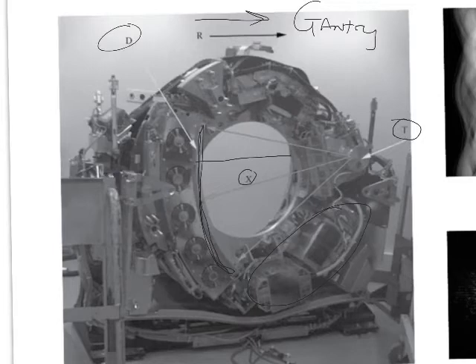So along this imaginary point that's the isocenter, if I were to stick somehow my pencil or whatever through this screen, and if you can imagine a line coming out from this X and hitting you in the forehead, that is the Z-axis. That's the Z-axis of the CT scanner.